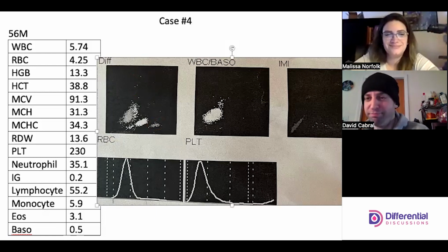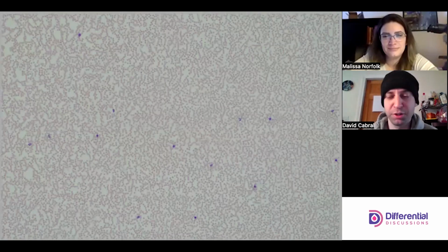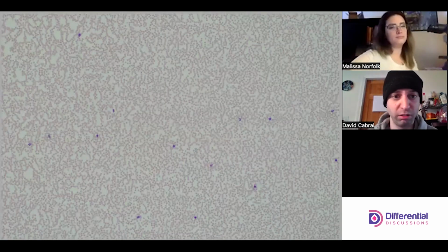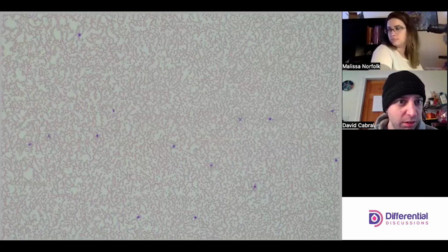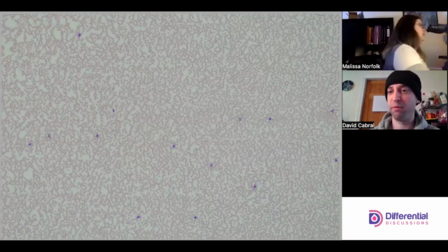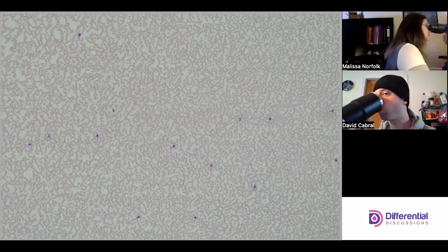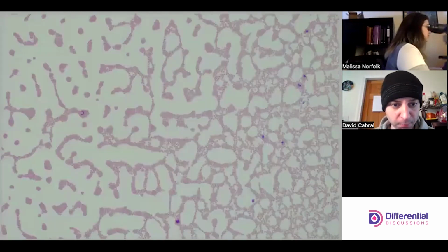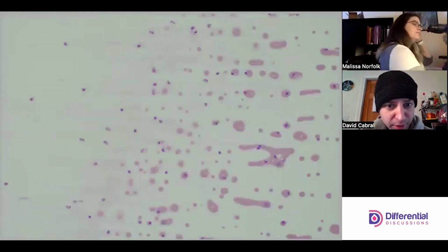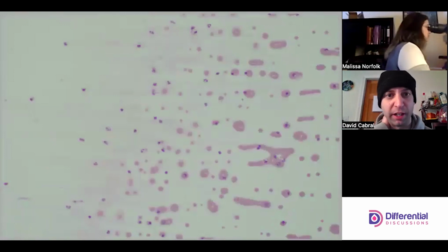I'm ready. Okay, so I'm looking at the red cell distribution, and it looks really, really normal and looks good. I'm seeing lymphs and polys. Yep, looks fine. Maybe we can just shuffle around a tad. I want to go to the feathered edge. Okay, please. So feathered edge is really good for looking for really large cells and platelet clumps and things like that. So I don't see anything particularly alarming out here.